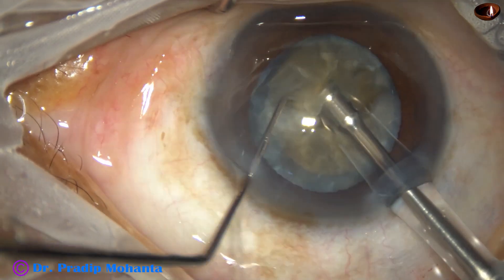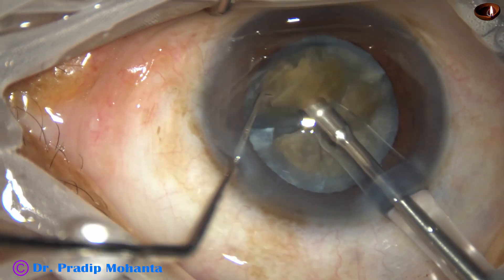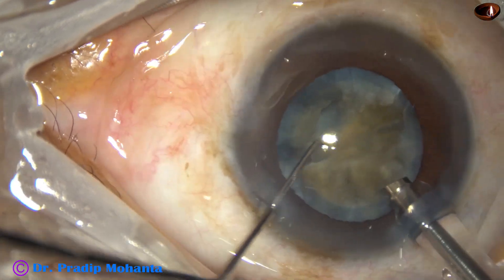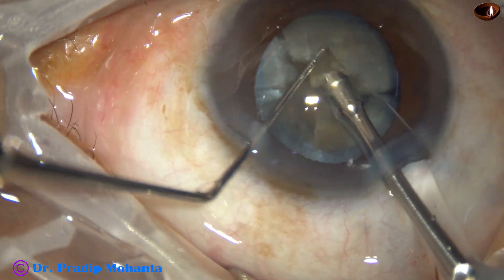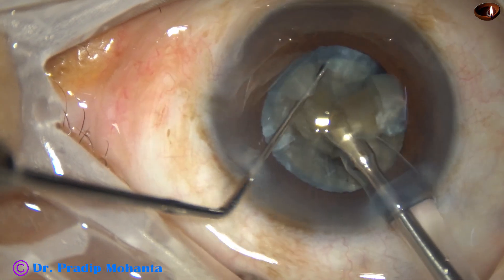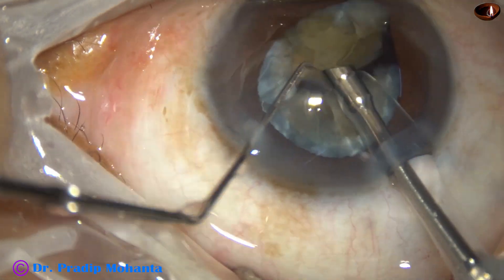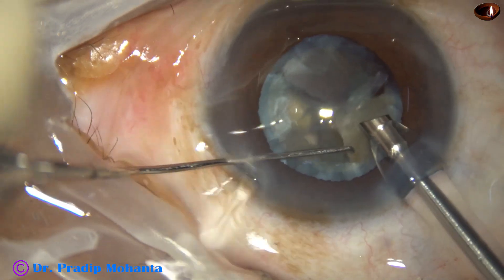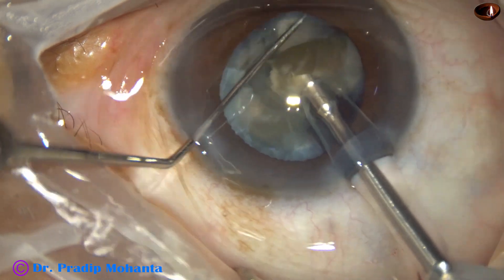Now think: if we do divide-and-conquer technique, how much time and energy we will spend. The longer the use of time and energy, the more damage to corneal endothelium. In the submarine chop technique, all the energy is delivered inside the nucleus — no ultrasonic energy, no heat energy comes to the corneal endothelium, and the cornea is crystal clear the next day.